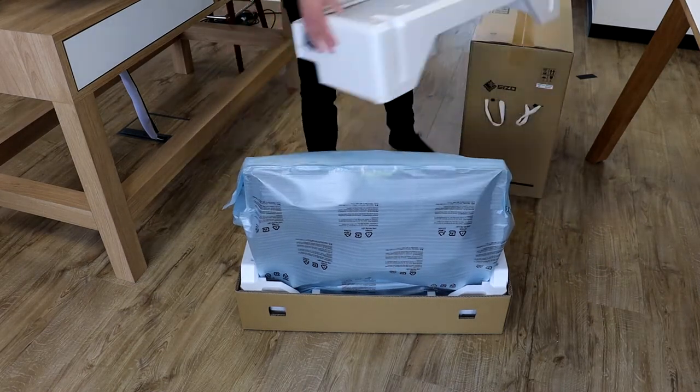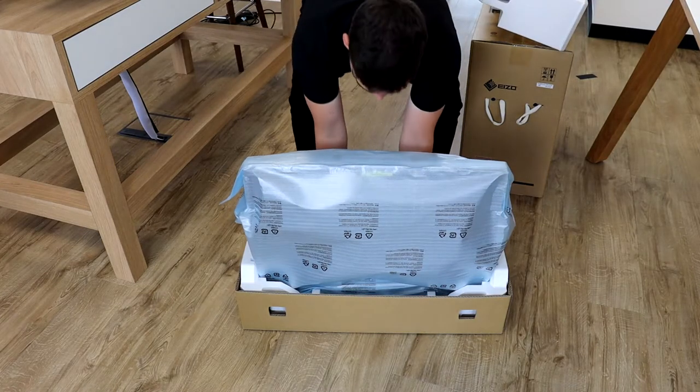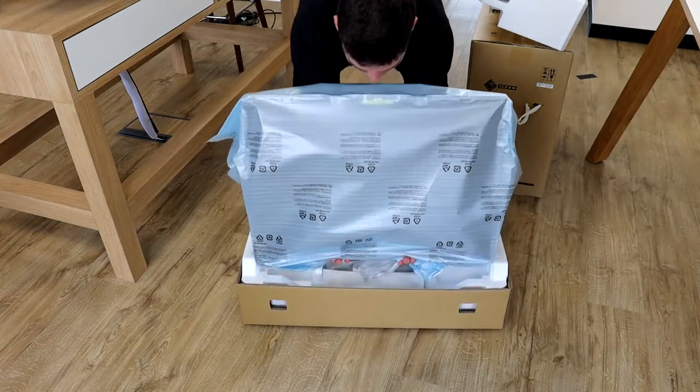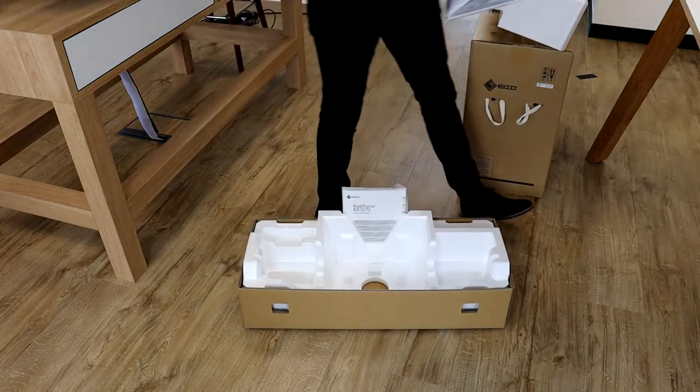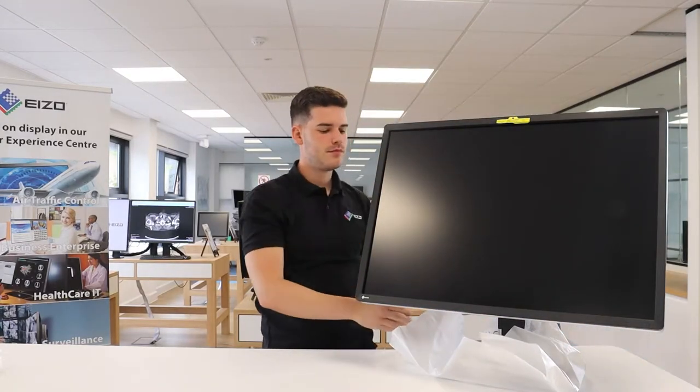Remove the polystyrene, which also contains the included cables. Lift the monitor up slightly to enable you to place both hands underneath, and then remove it ensuring no pressure is applied to the LCD panel itself. Remove the protective bag including the base stand cover.